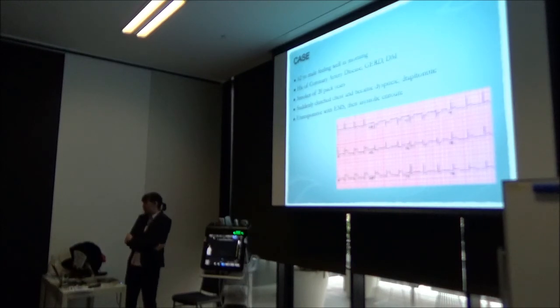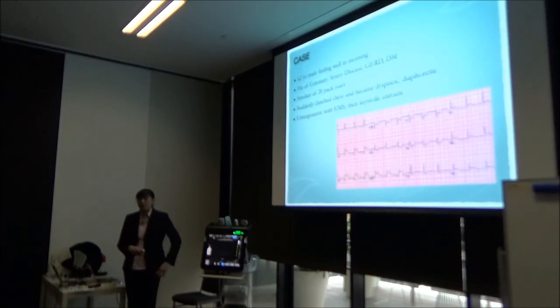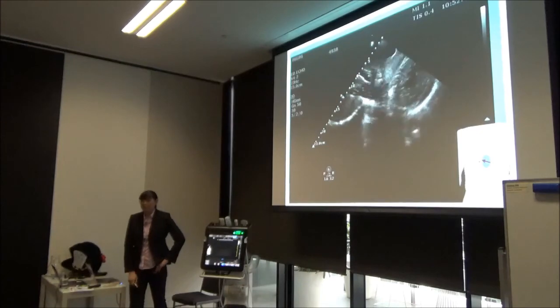Do you guys have that here? Can EMS activate the cath lab? Yeah. So they activate the cath lab, but then they make a pit stop with us because he becomes asystolic. What's going on?